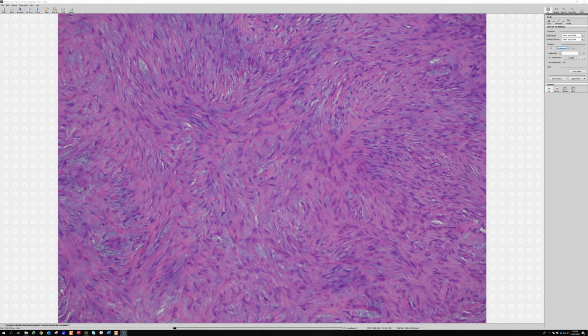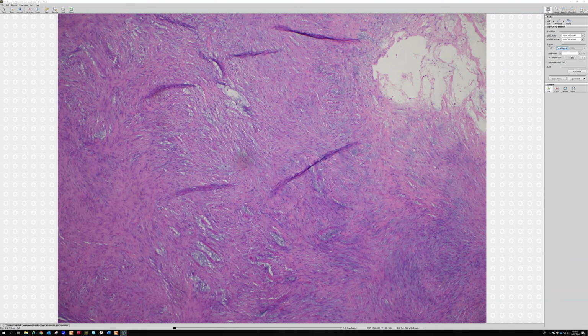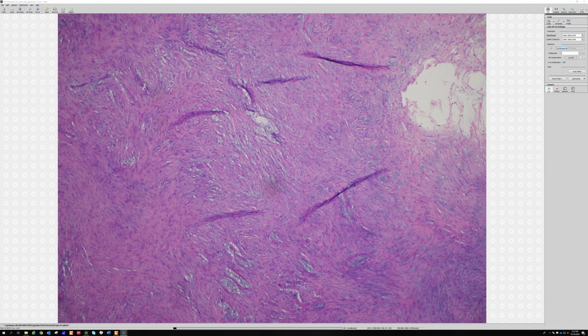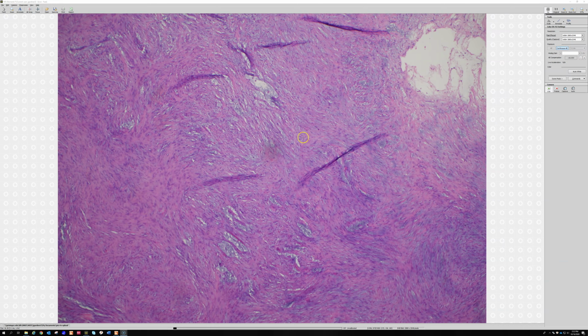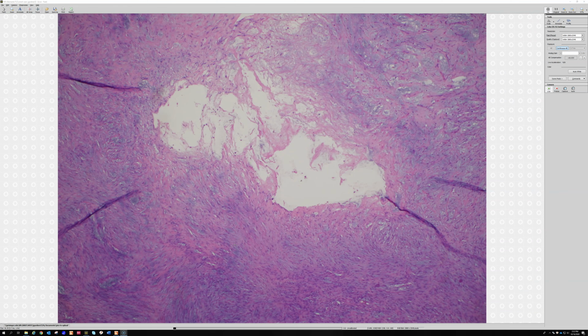But for a lot of people, they may not know what that looks like. So to me, I think this looks kind of loose and feathery. Those are the kind of visual terms I use. And I find one of the most helpful features to be the presence of these cystic myxoid little microcysts. Cystic degeneration with myxoid change is really classic and present in the majority of cases of nodular fasciitis that I see. Sometimes it can be even bigger cysts.